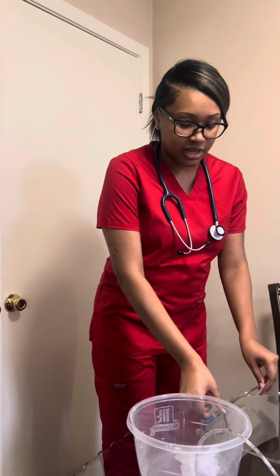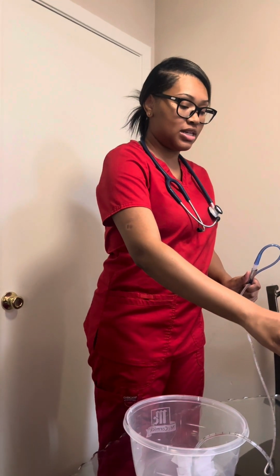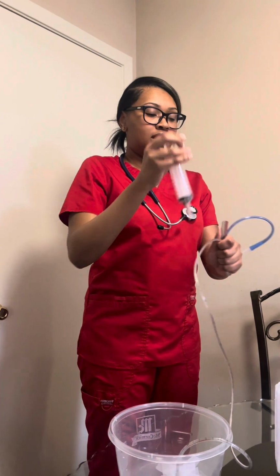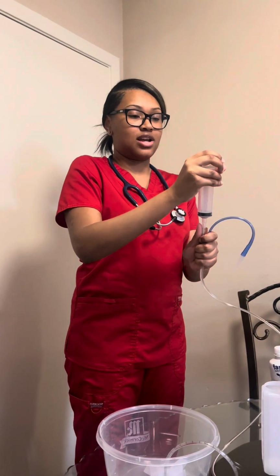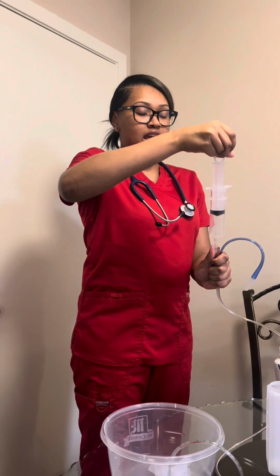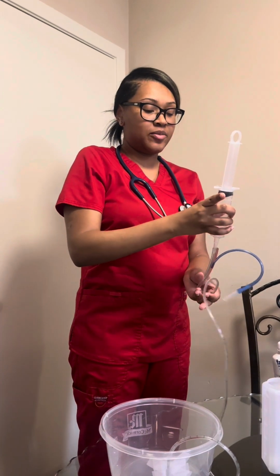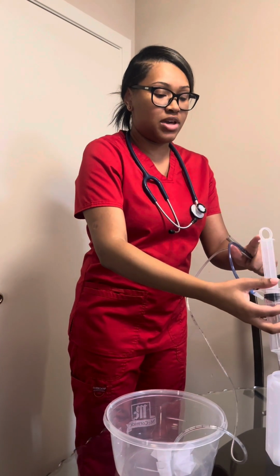Then I would check the gastric content residual. I would clamp this, and clamp it, and I will unclamp it. I will pull this up, and I will just aspirate all of the gastric content to measure.